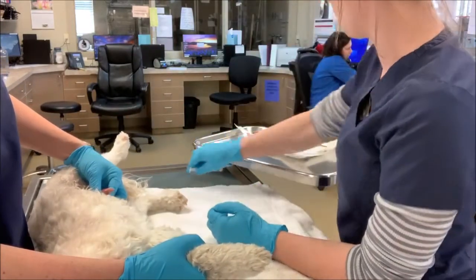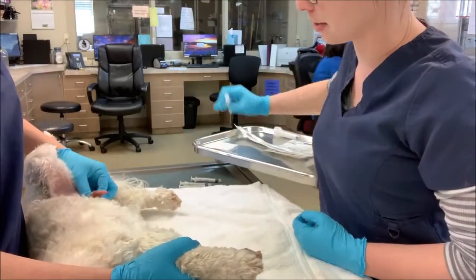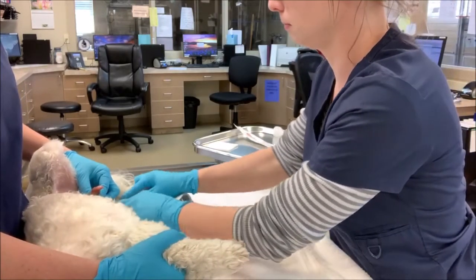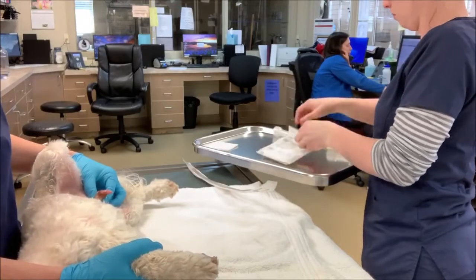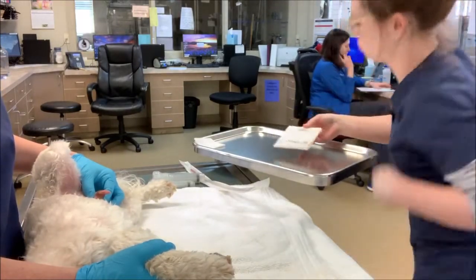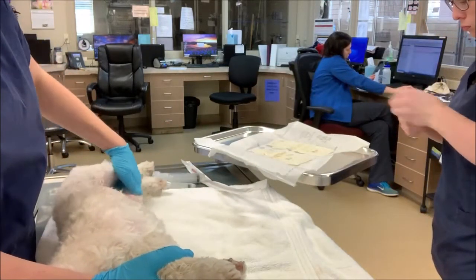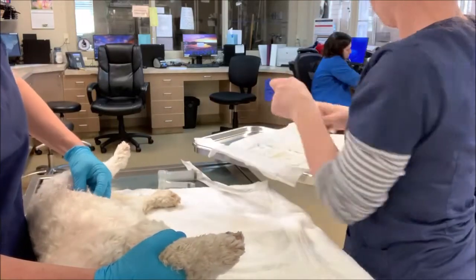I pulled it up individually just to show what I'm doing. I will be using sterile gloves. I'm going to lay my gloves out and get everything that I need sterilely. I'm going to open up my lube and squirt a little bit, without touching it, onto my glove paper. And I'll open up a syringe to keep that sterile as well.